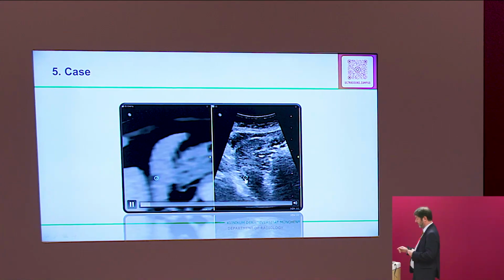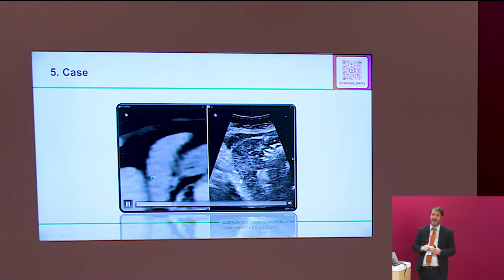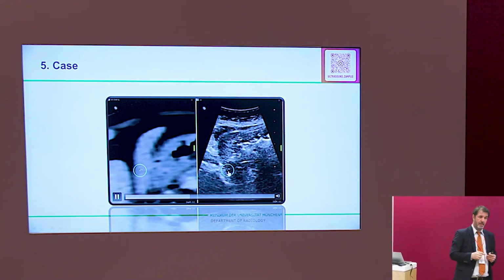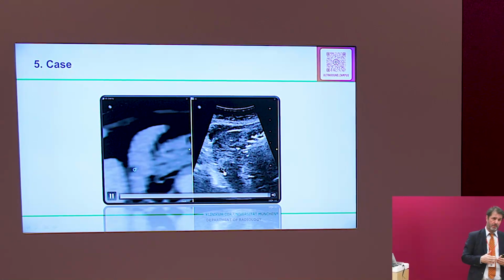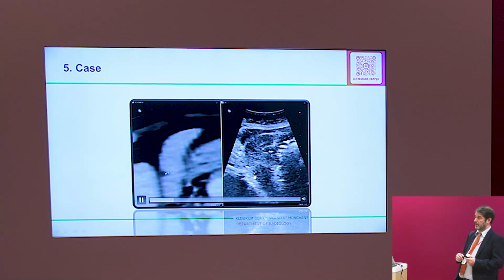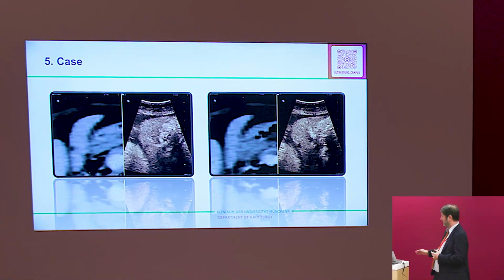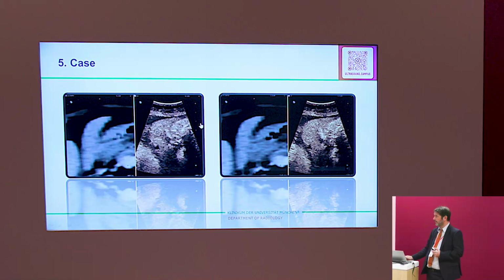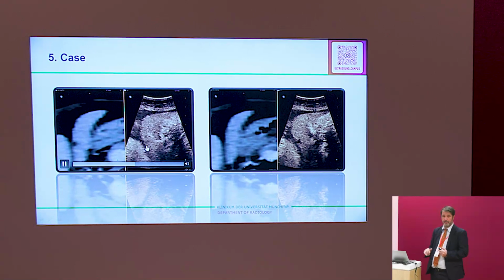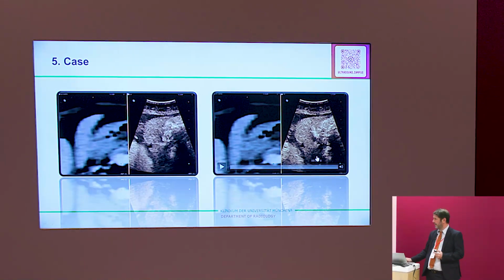Yeah, on the right, here, where the blue circle is, where the mouse cursor is. It's black in the midfield. Black, that's very good. Black means most of the time liquid in ultrasound. So, high suspicion of a cystic lesion. So, we inject contrast. What is here? Is it still black? Yes. Is it still black also here?